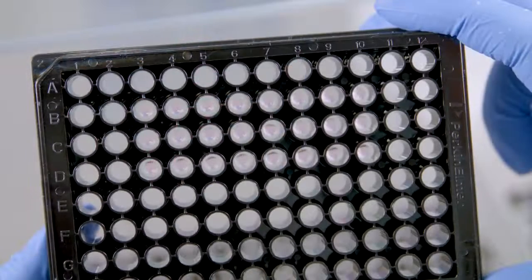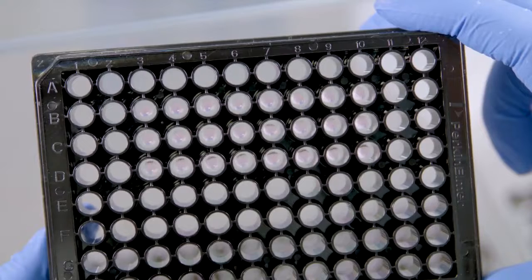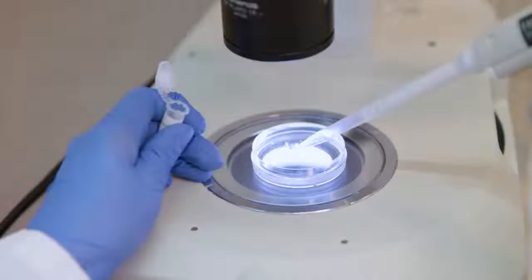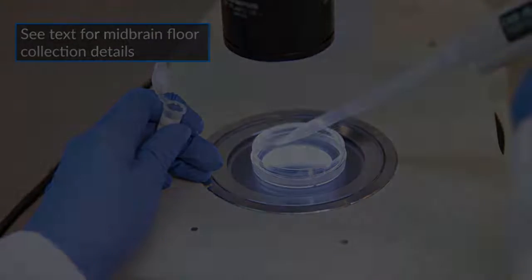Add 10 microliters of medium to the middle of each coated island to create microislands. To set up primary embryonic midbrain cultures from mouse embryonic day 13.